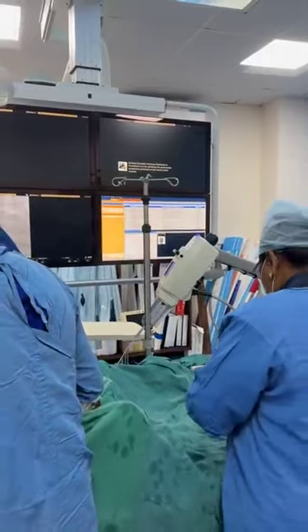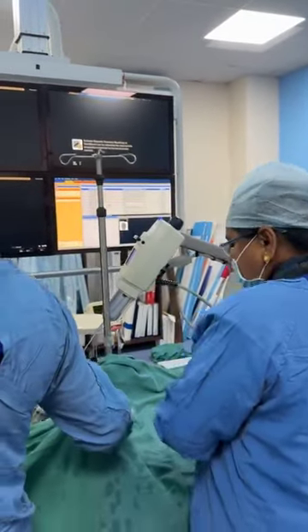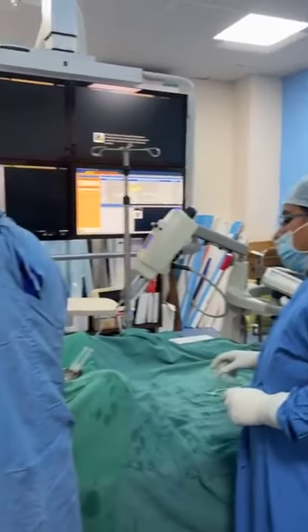Want to put the umbilical tape distally? No, sorry. Okay. Take. That will be.